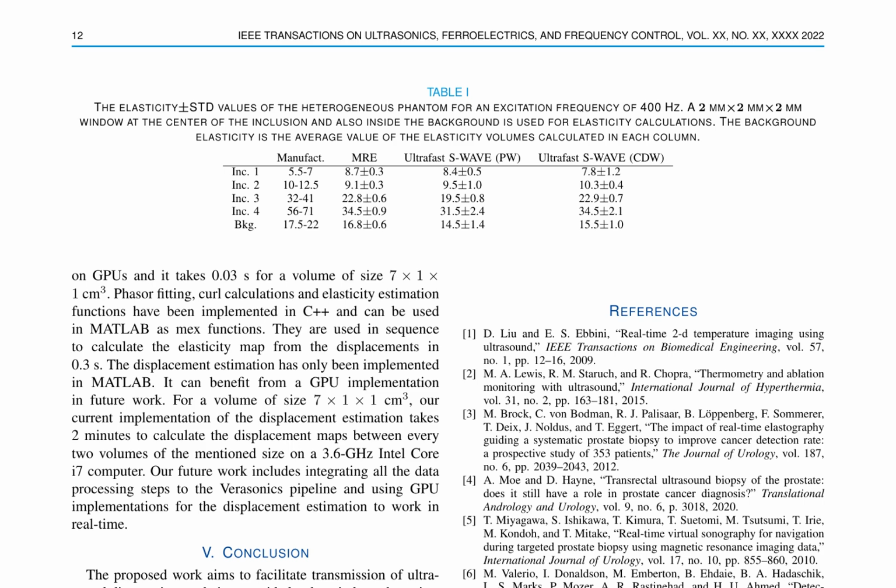The paper introduces a novel real-time, three-dimensional imaging technique utilizing the SWAVE method for prostate cancer detection in diagnostic care. This approach aims to enhance the efficiency and accuracy of targeted prostate biopsies by integrating magnetic resonance imaging (MRI) data with ultrasound. The proposed method employs a matrix array transducer connected to a Verasonics ultrasound machine, enabling the acquisition of 100 RF volumes at frame rates of 2000 volumes per second.